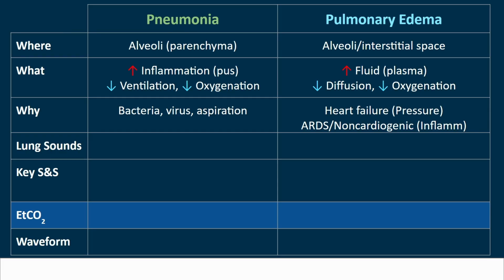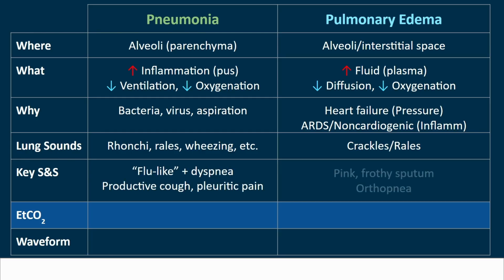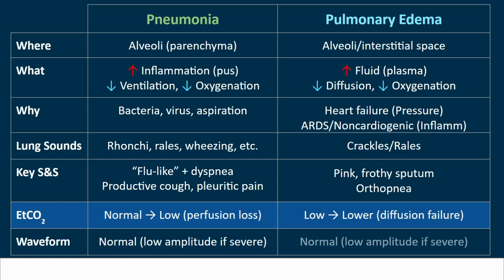There you go. I don't mean to say that you don't have ventilatory problems, because of course oxygenation is an issue because the oxygen can't be ventilated in appropriately, but CO2 will largely go out. So if we come down to waveform and skip ahead, what do I expect to see in a waveform for something with pulmonary edema? Okay, you did a great job. I led into that like I expected bronchoconstriction, but fantastic. We might see a more normal waveform.